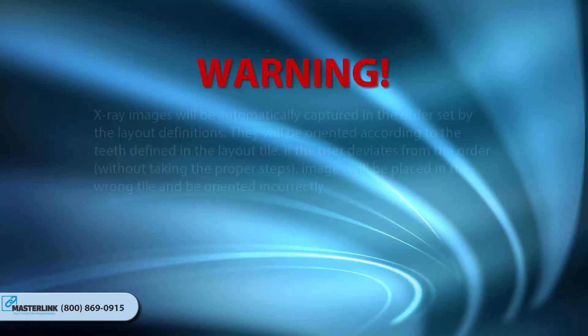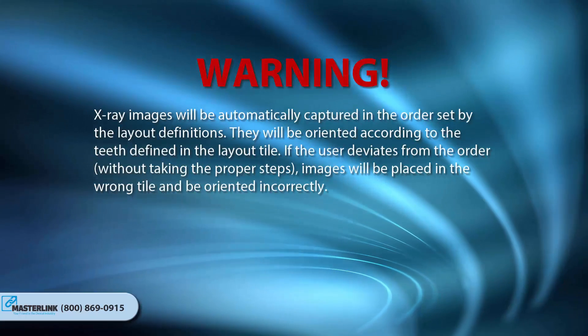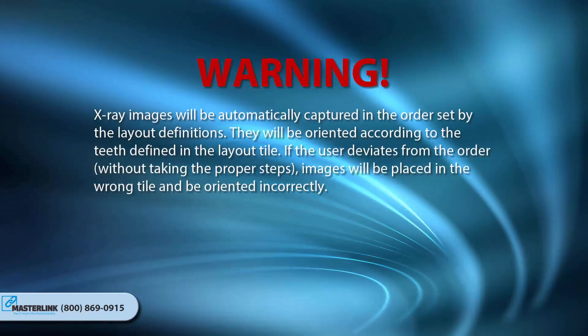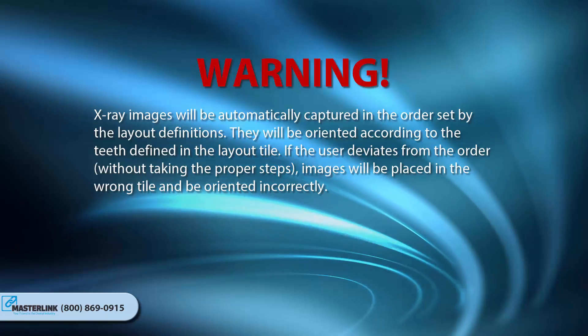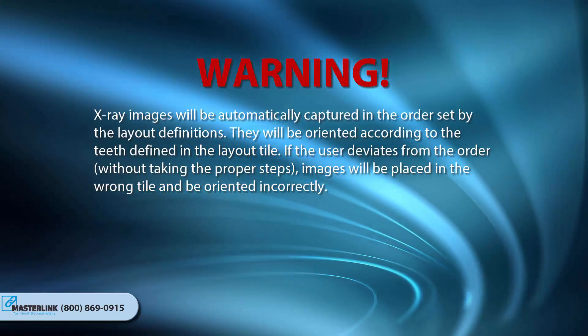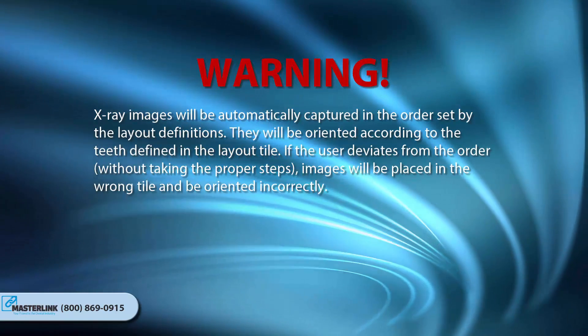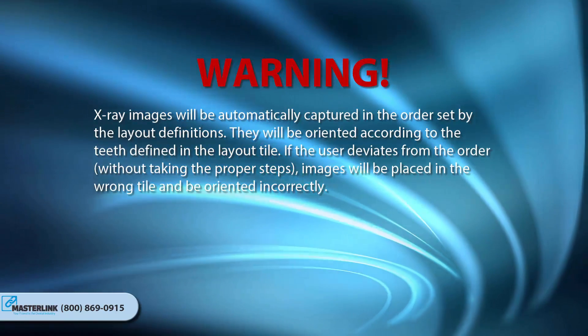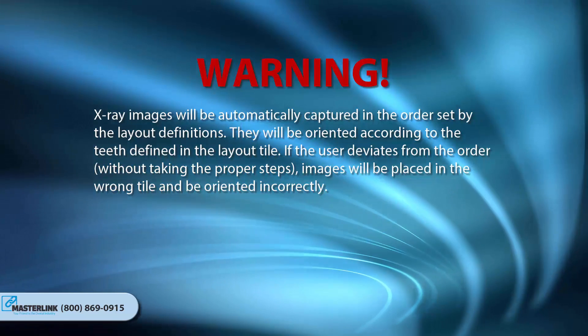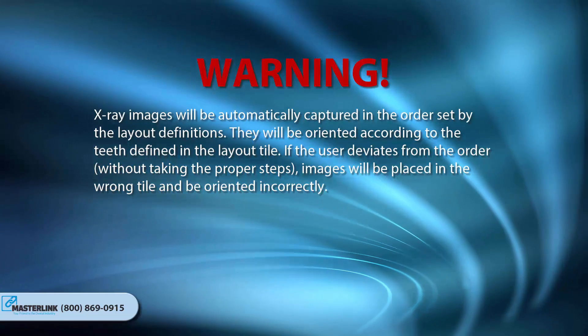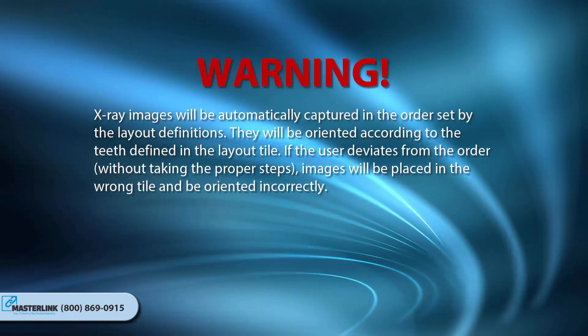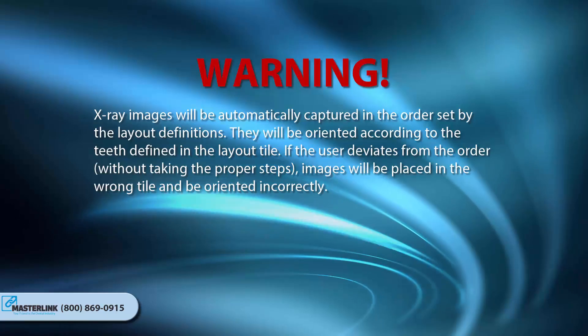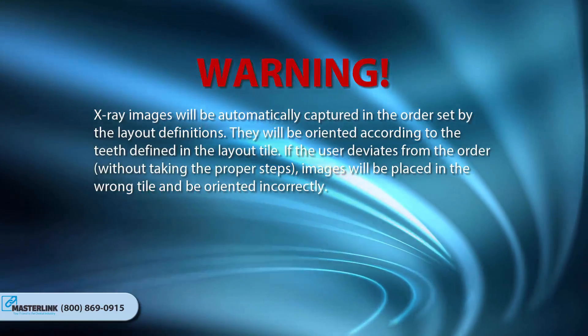Warning: X-ray images will be automatically captured in the order set by the layout definitions. They will be oriented according to the teeth defined in the layout tile. If the user deviates from the order without taking the proper steps, images will be placed in the wrong tile and be oriented incorrectly.